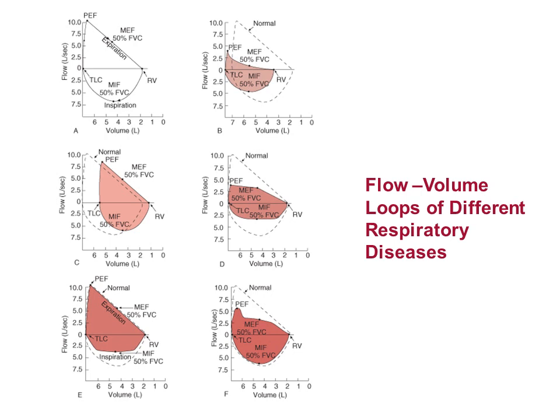So during inspiration there will be no problem because the lung will increase in size and open all bronchioles, while during expiration, because of the weak cartilage, the bronchioles will be almost obstructed, and there will be difficulty in getting the air out. So the cut in the curve will be during expiration.